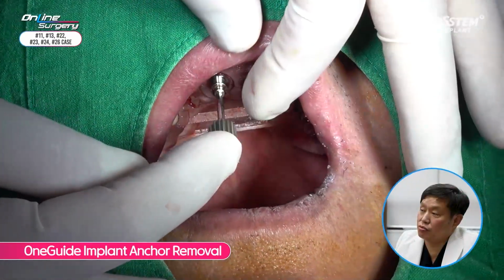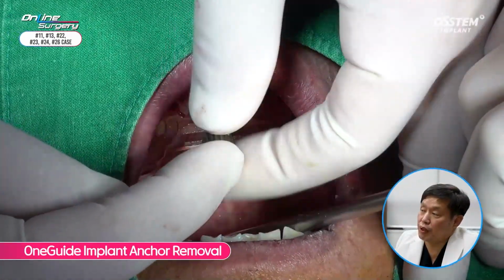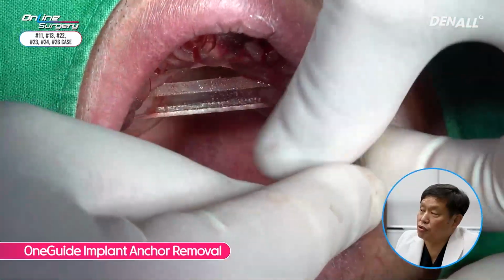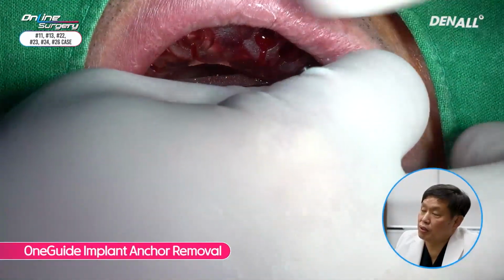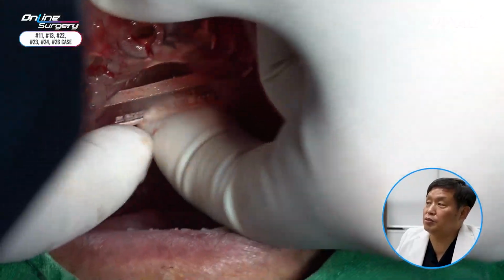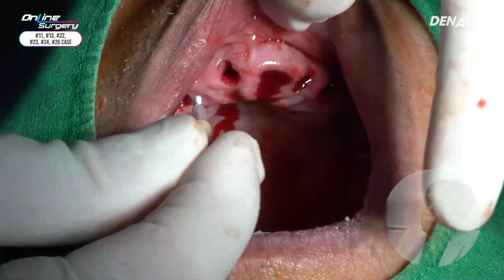In number 11, where the implant anchor was, it was removed, and in number 24, the implant anchor was removed and the template was removed. The implant placements were complete.